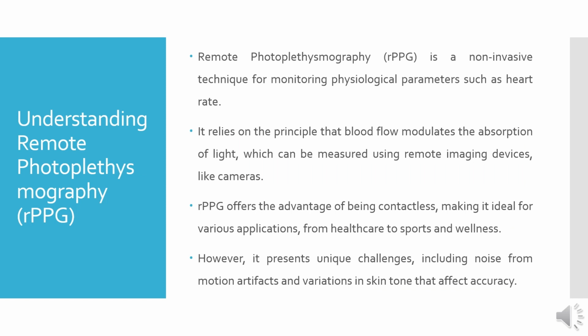Hi everyone, this is Shushant and today I'll be explaining the rPPG algorithm. So rPPG stands for remote photoplethysmography. It's a non-invasive technique for monitoring physiological parameters such as heart rate. It relies on the principle that blood flow modulates the absorption of light and that can be measured using remote imaging devices like cameras or other imaging devices.